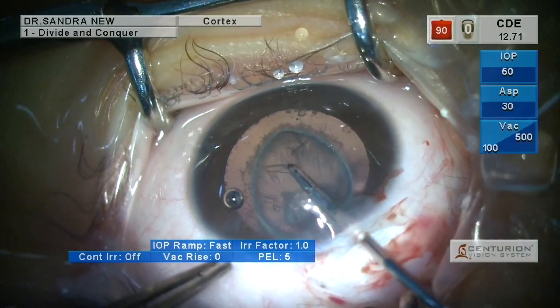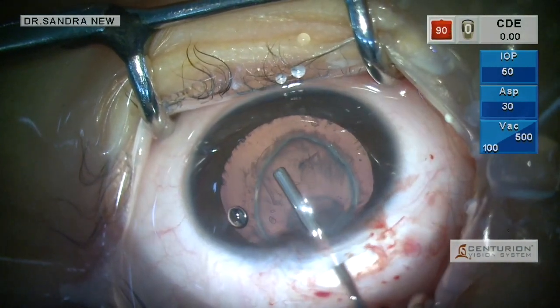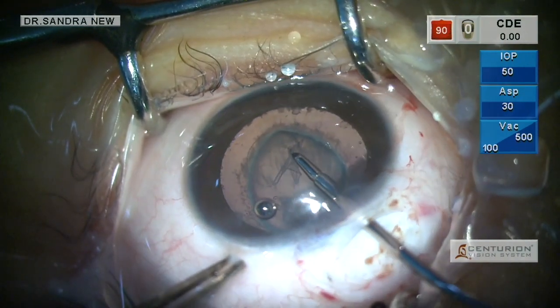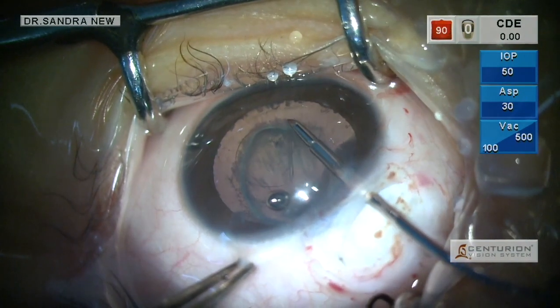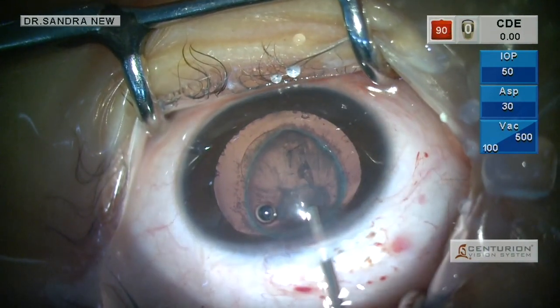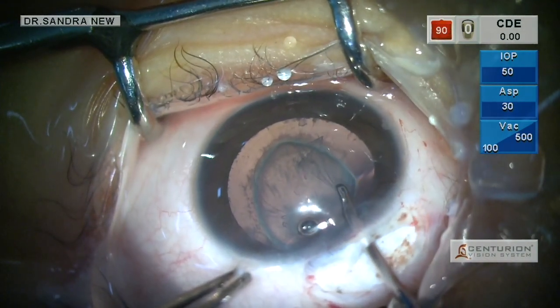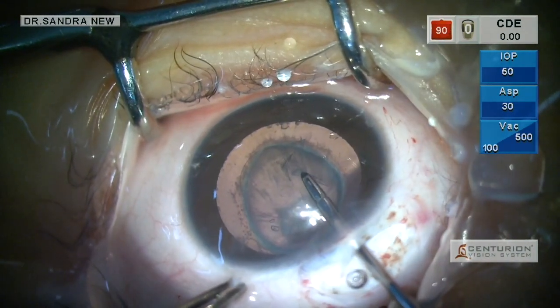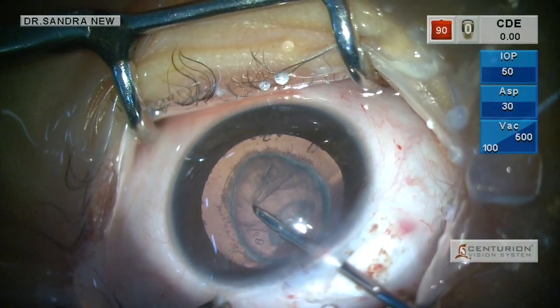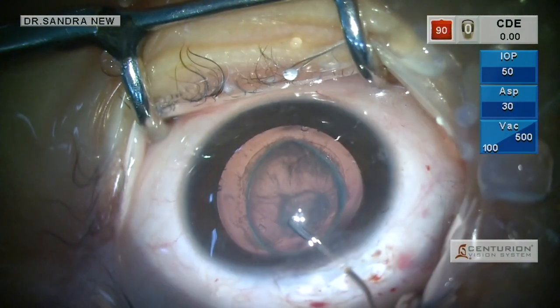The correct size and centration of the rhexis is of paramount importance in pediatric cataract. The rhexis, as opposed to that in adults, is very elastic and continuously has to be grasped and re-grasped very frequently in order to direct the force correctly towards the center of the eye. You can see that I am always holding the tearing edge and directing the force towards the center. So the rhexis is now complete.